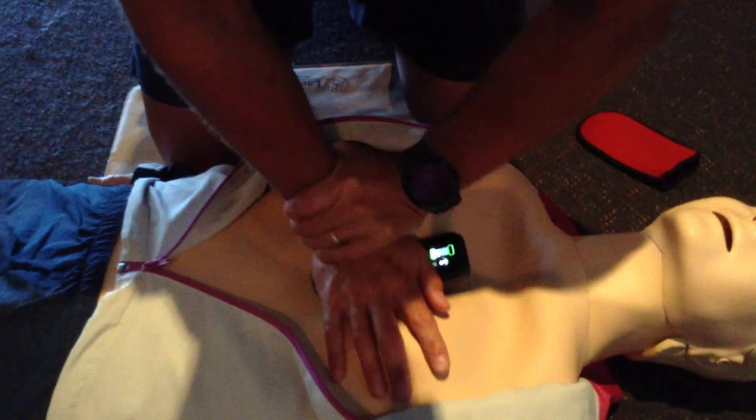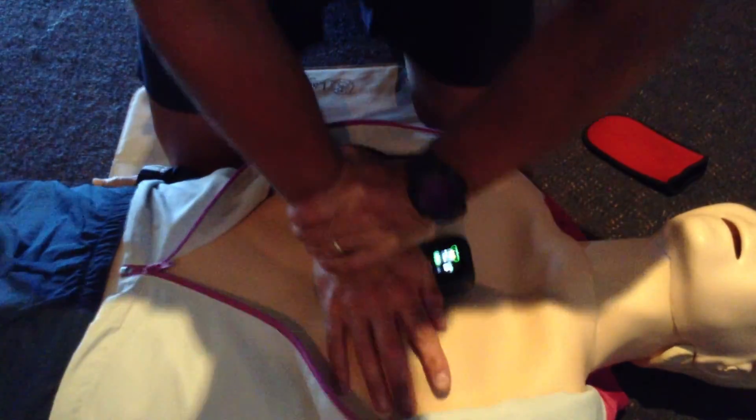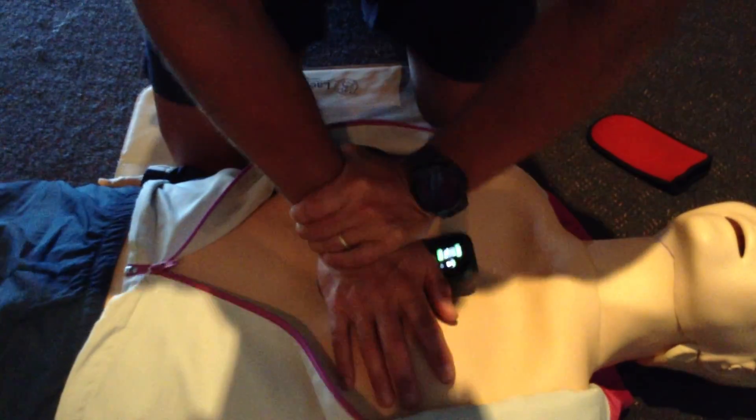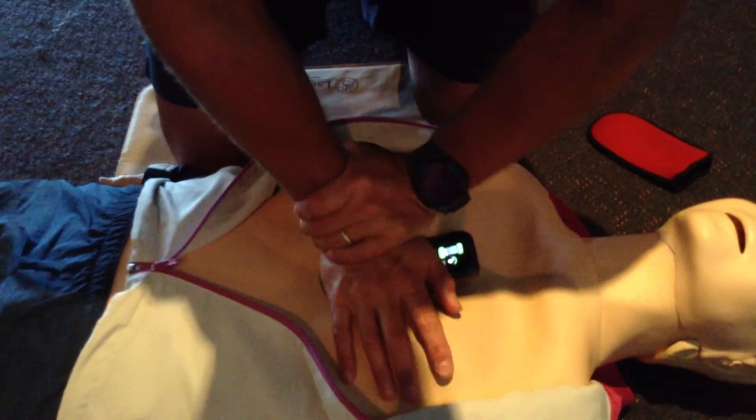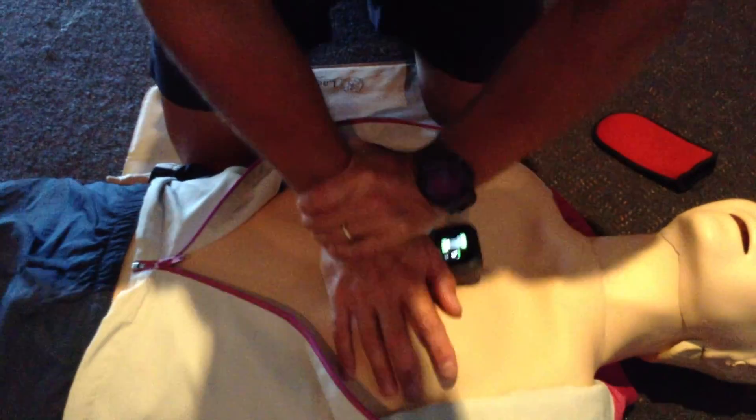If I now achieve an adequate depth but don't release effectively, we'll see the reverse happen, and I can correct that quite quickly. If I achieve adequate depth and release but go too slowly, you'll see that the little rate counter is dropping way off.